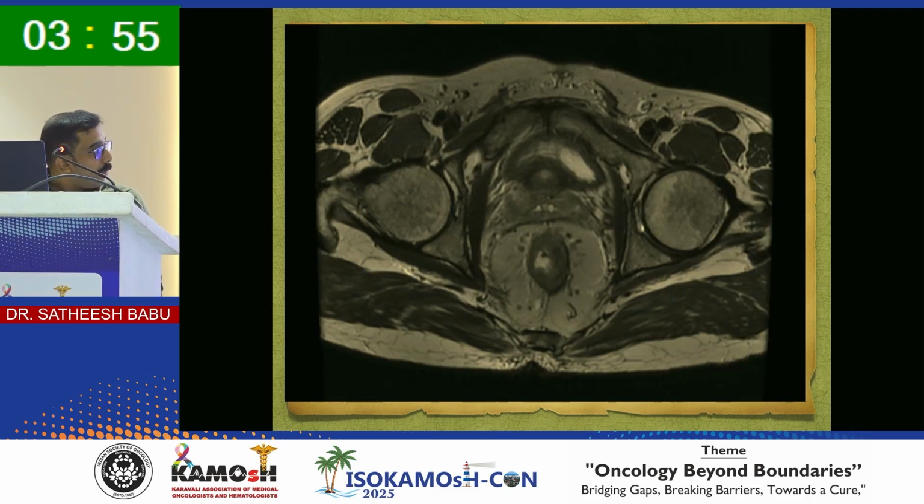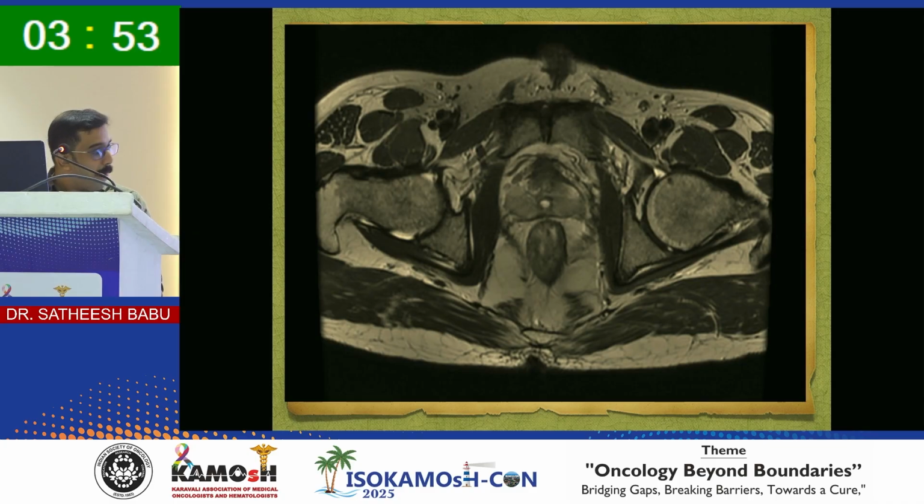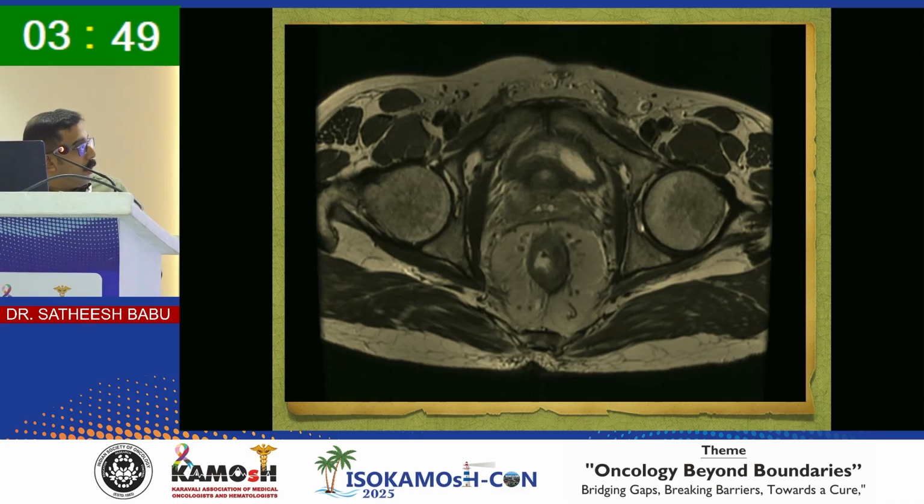Whereas, if you go back, these black lines are not infiltration, it's actually desmoplastic reaction.